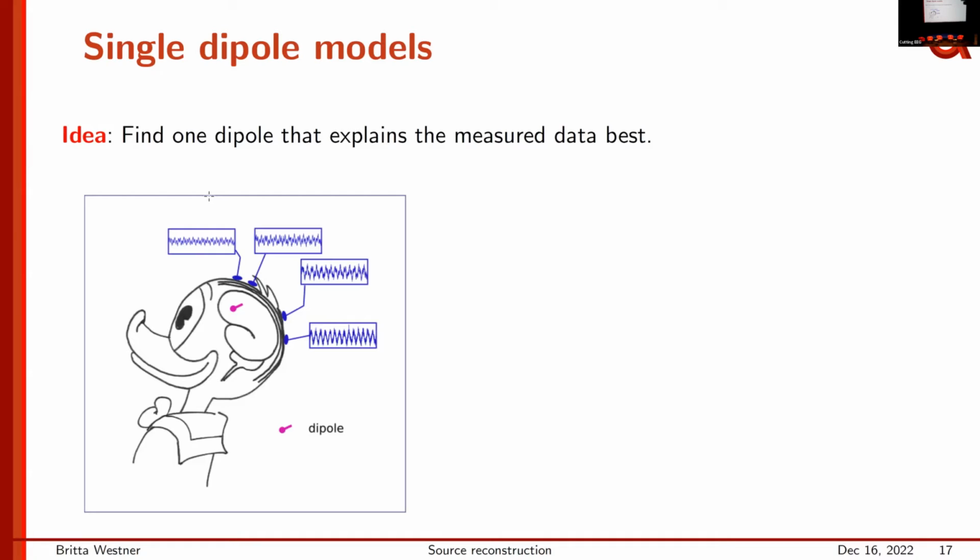And while he was thinking about that, we recorded from 4 electrodes on his feathery brain. And as we have seen yesterday, what we record here is a linear mixture of different sources. So you can see that there is a little more high frequency activity on the frontal channels and a little more low frequency activity on the channels in the back. And what we want to do now is manipulate this dipole here such that it explains what happens up here the best.